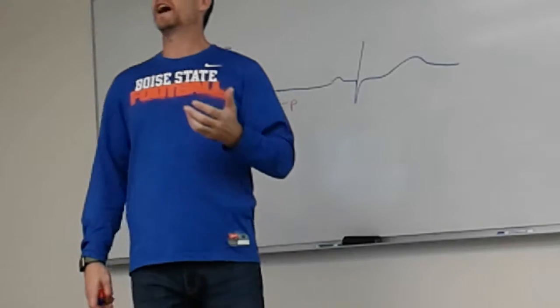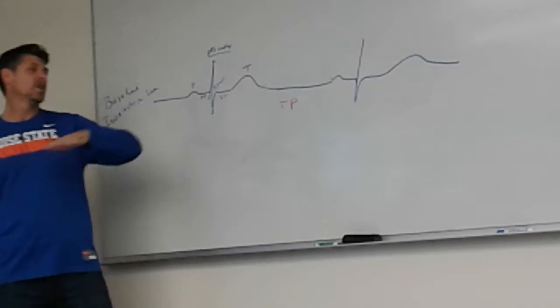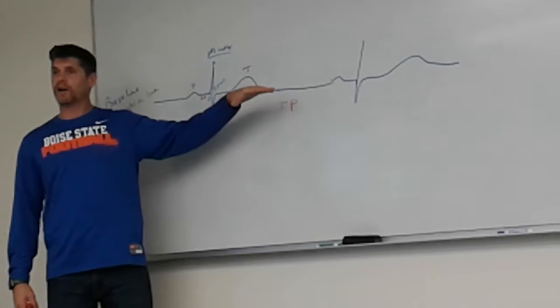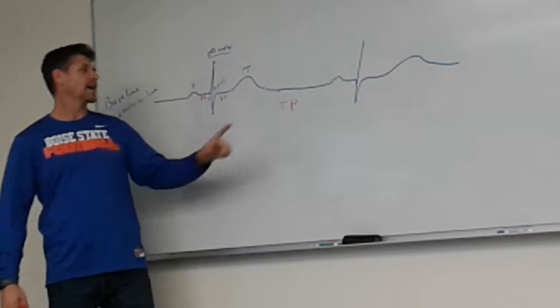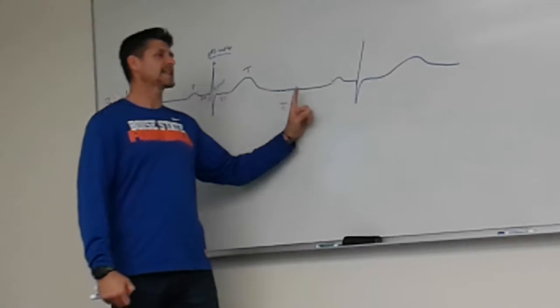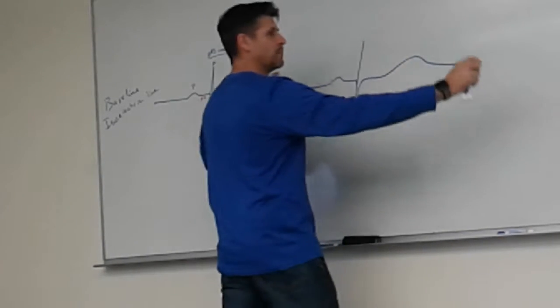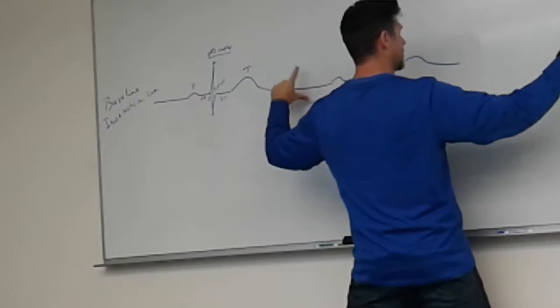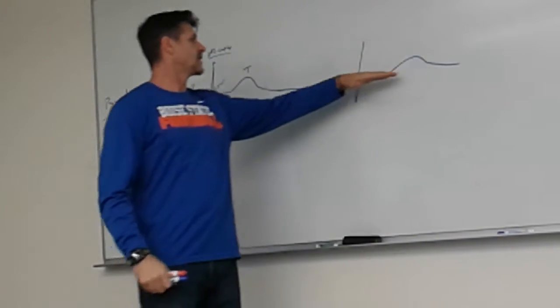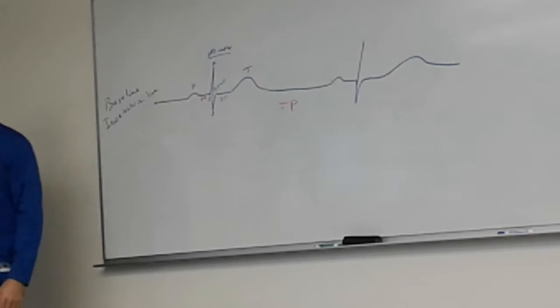The way that we use that to find our baseline would be to set that ruler on our EKG, so we can still see the EKG in the background, and put that red line on our TP segment, and follow it from that TP segment to the next TP segment, so that both of these two TP segments were on that line. And as that line cuts through the entire cardiac cycle, that's our isoelectric line.